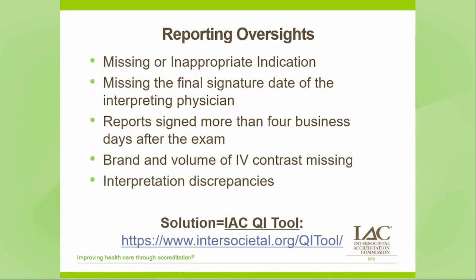And as you may have guessed, manual or handwritten signatures must have a manual or handwritten signature date. Now, some common oversights that are encountered include a blank after the header, or in the case of manual or handwritten signatures, this item is sometimes missing altogether. For electronic signatures and electronic signature dates, keep in mind that the dates of dictation and transcription, preceded by DD and DT respectively, aren't sufficient. Also, electronic signature dates must also include a timestamp.